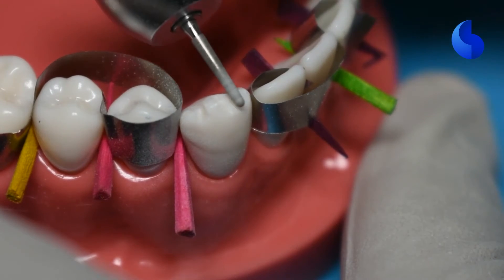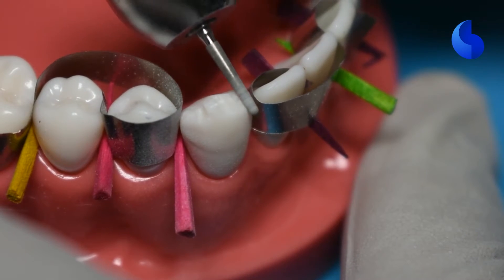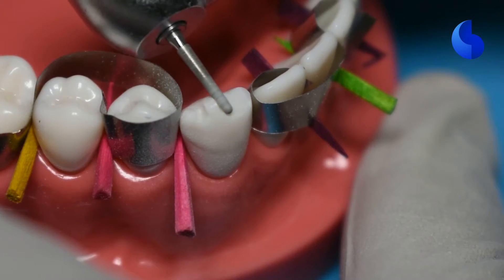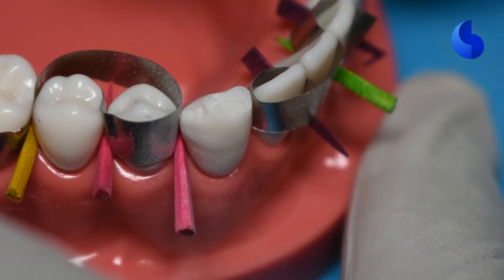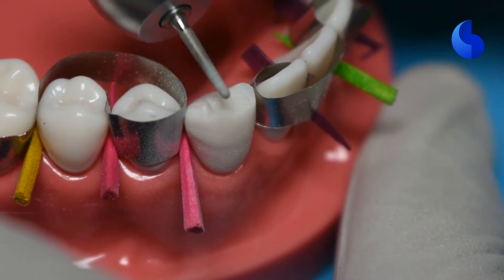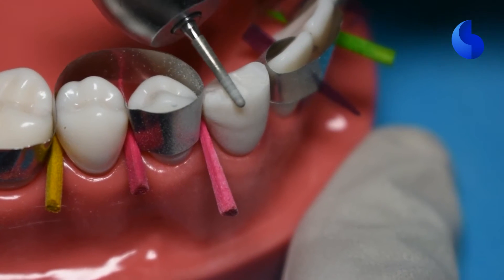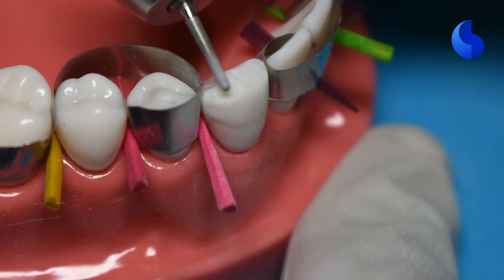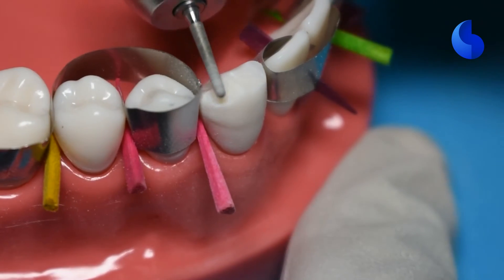Start by reducing half of the incisal edge at a time, and then once you've verified the clearance, you can move on to the other side. We're giving very smooth, swift movements here to make sure that you're not creating any ditches. And while you're doing this, since this is a canine, you have to ensure that you maintain the occlusal anatomy of this tooth. The canine does have one cusp, so we have to make sure that we continue to preserve that instead of flattening it out.